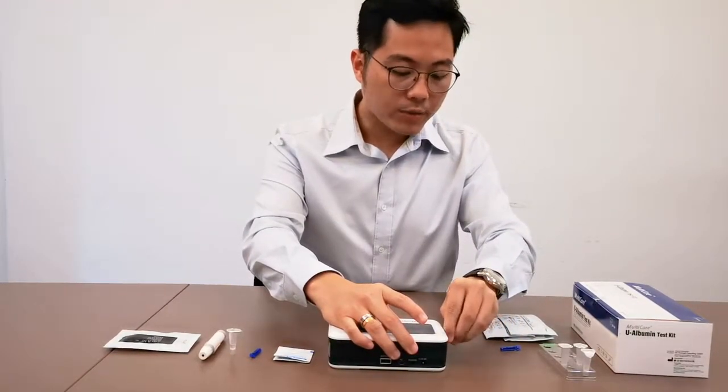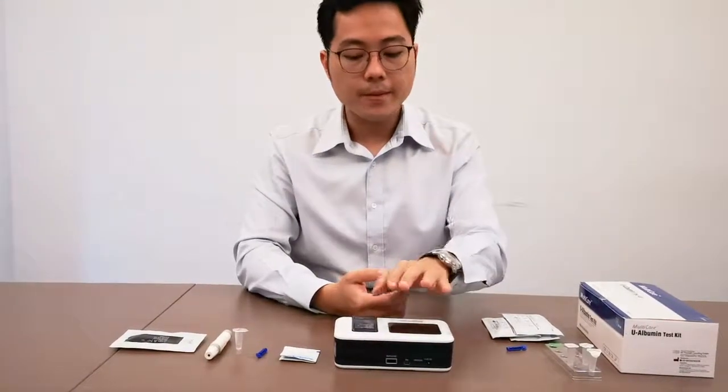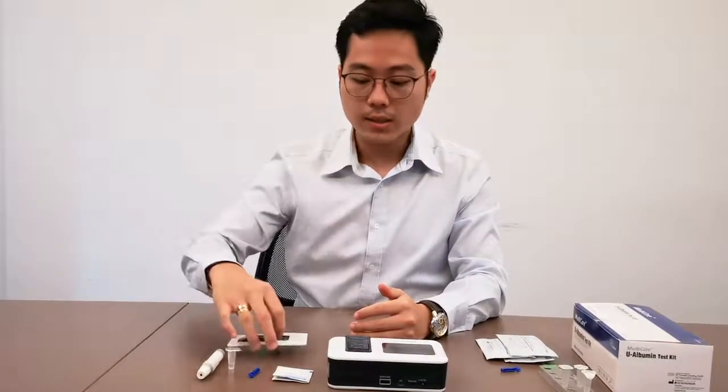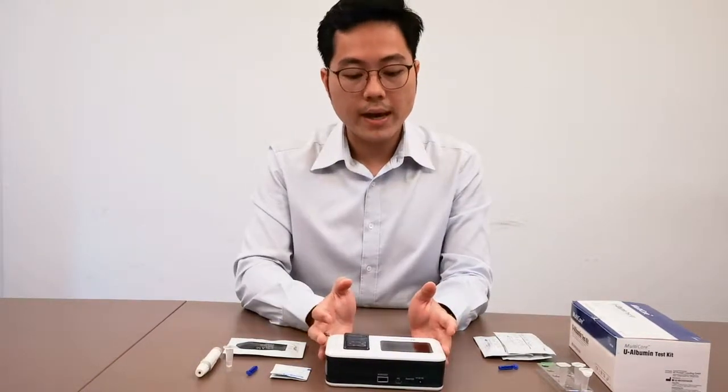You only have to do this one time, or the first time, because the machine will actually remember the last code that you inserted for your HbA1c. So if you are using other tests like the CRP, the lipid, and whatnot, you don't have to reinsert the code chip.